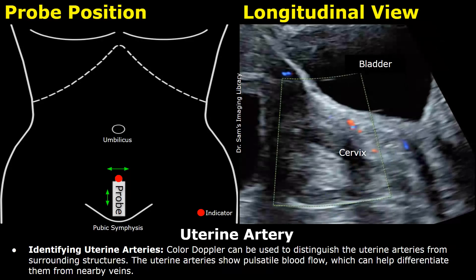When color Doppler is applied, you will find the pulsatile flow, which will basically be an alternating color between different shades of red and also some shades of blue. This will indicate a pulsatile flow. This feature will help in distinguishing the uterine arteries from nearby veins.